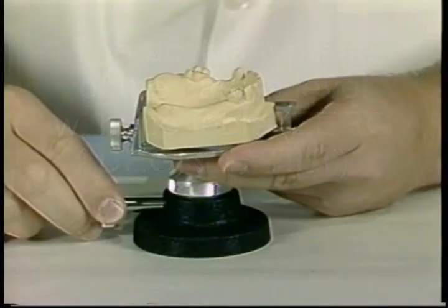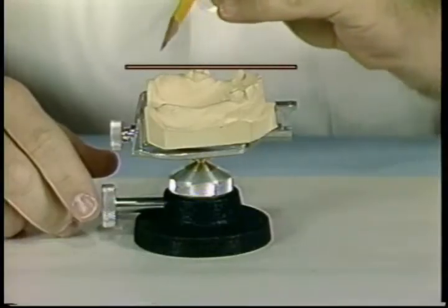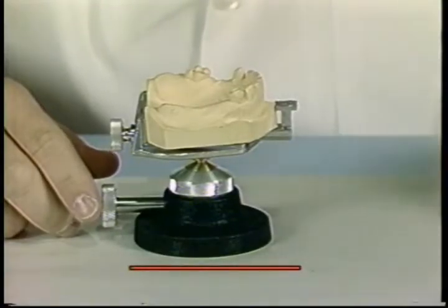To begin surveying, the occlusal plane of the cast is level with the table, that is, at a 0-degree tilt. The cast may be tilted anteriorly.